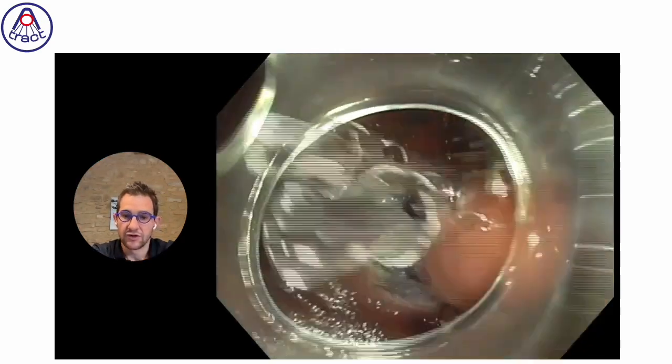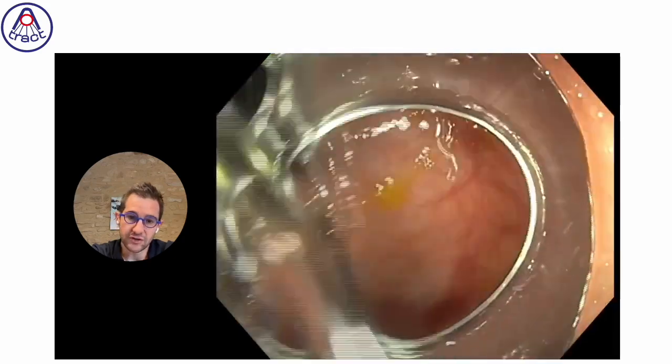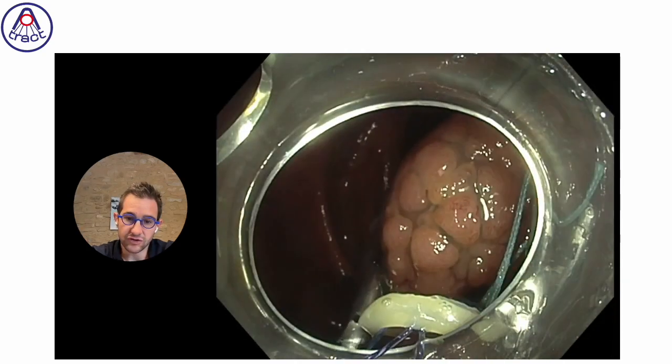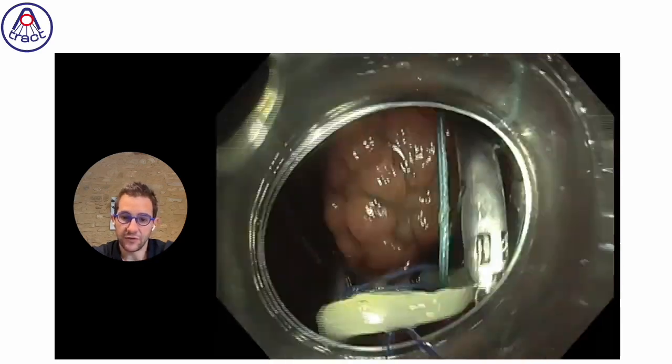which will be a little more difficult to achieve. And once the 4 points traction is done, you can see here that we have an initial traction, but it's not very strong. The field of view is not clear enough for me.